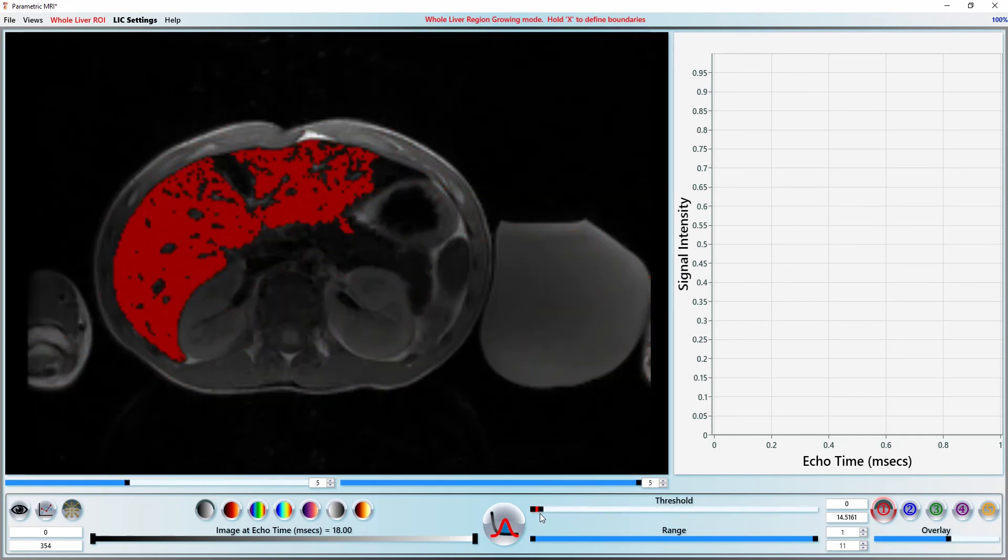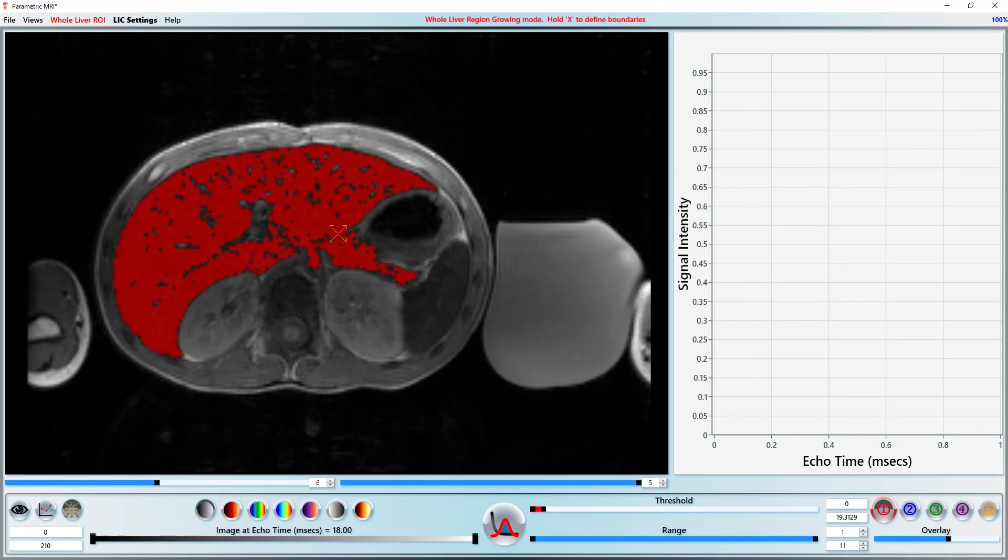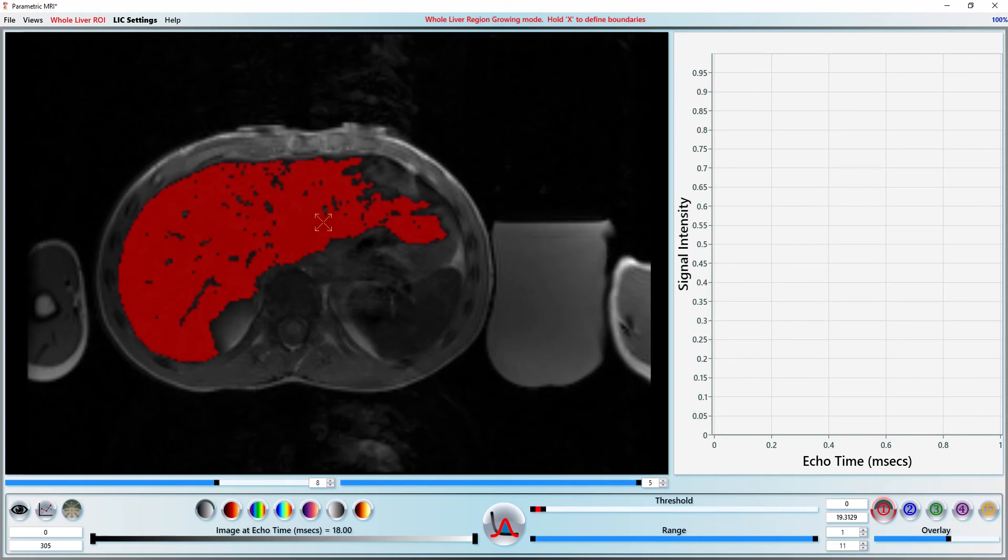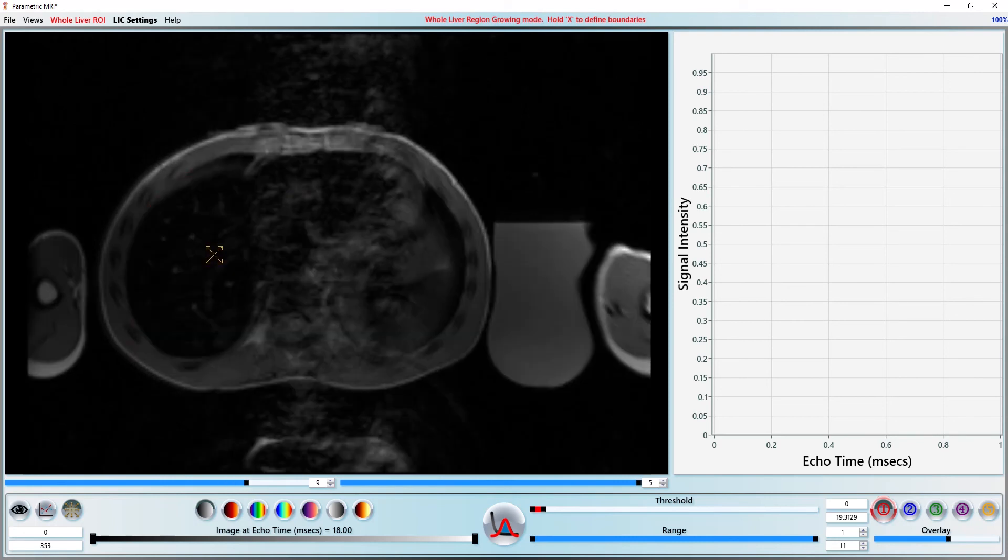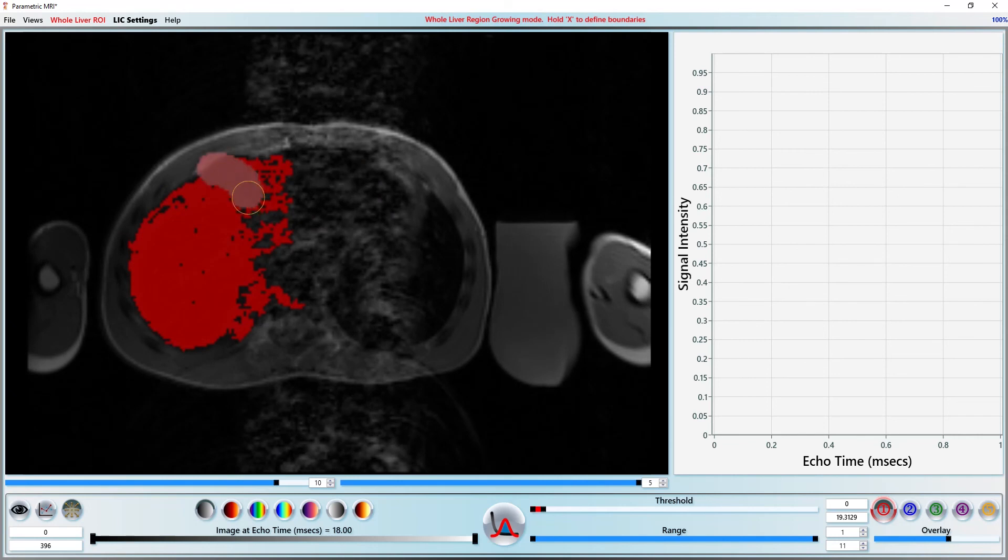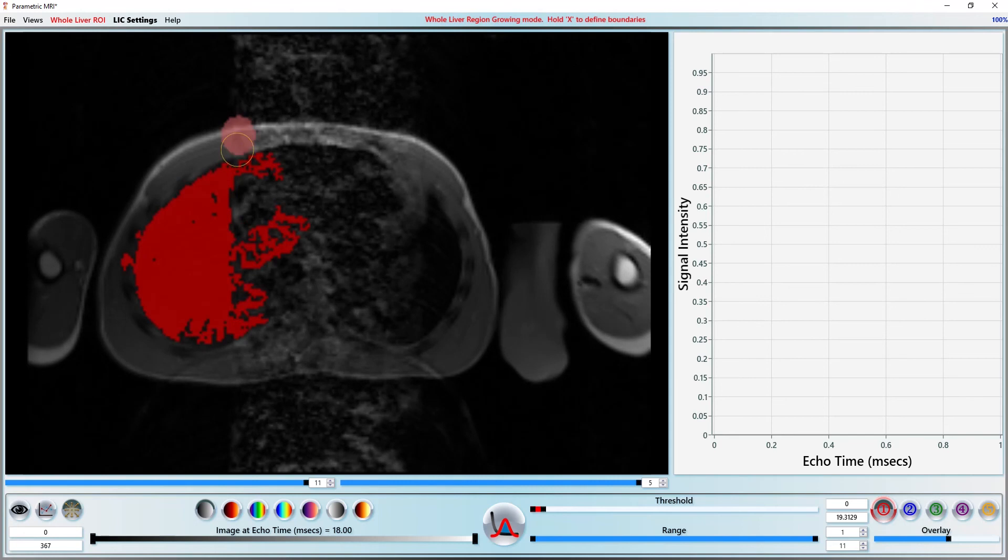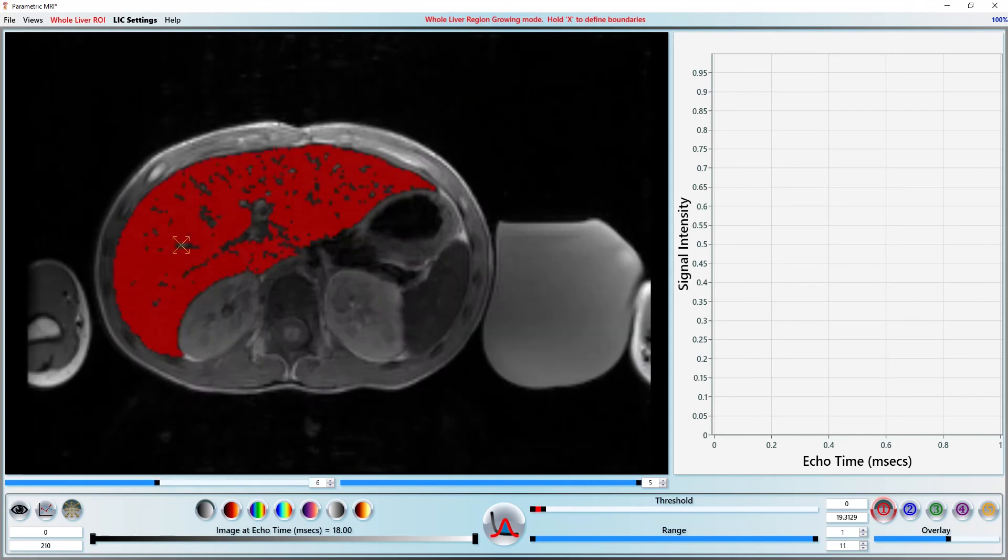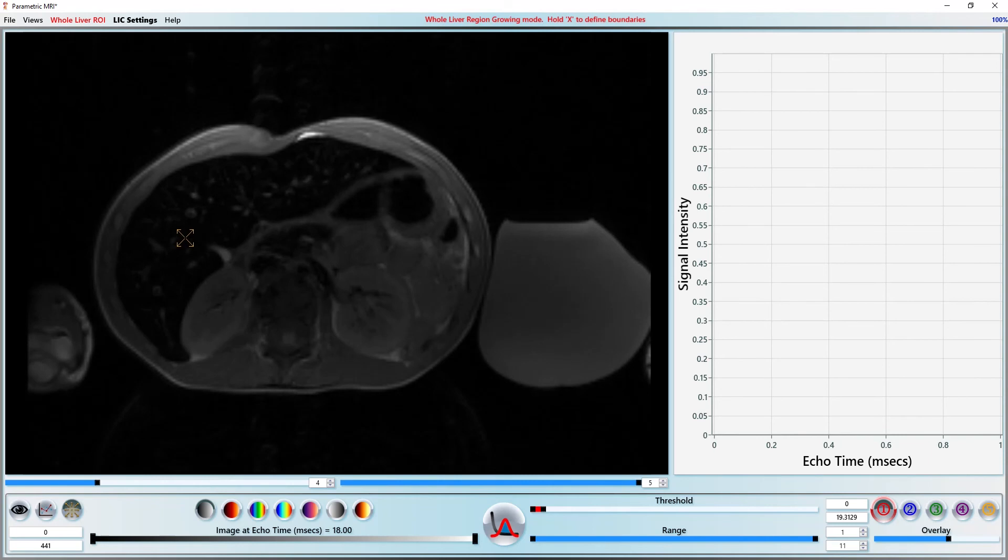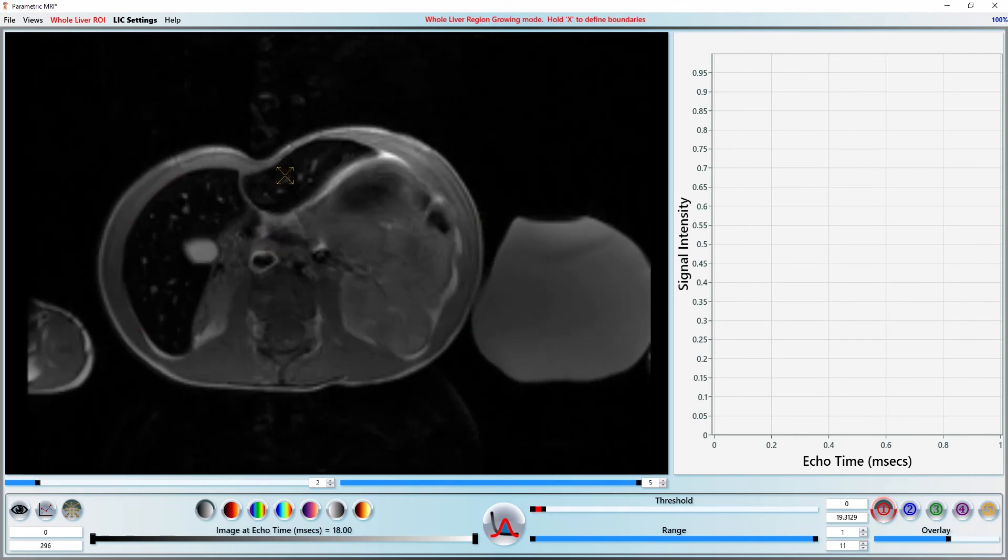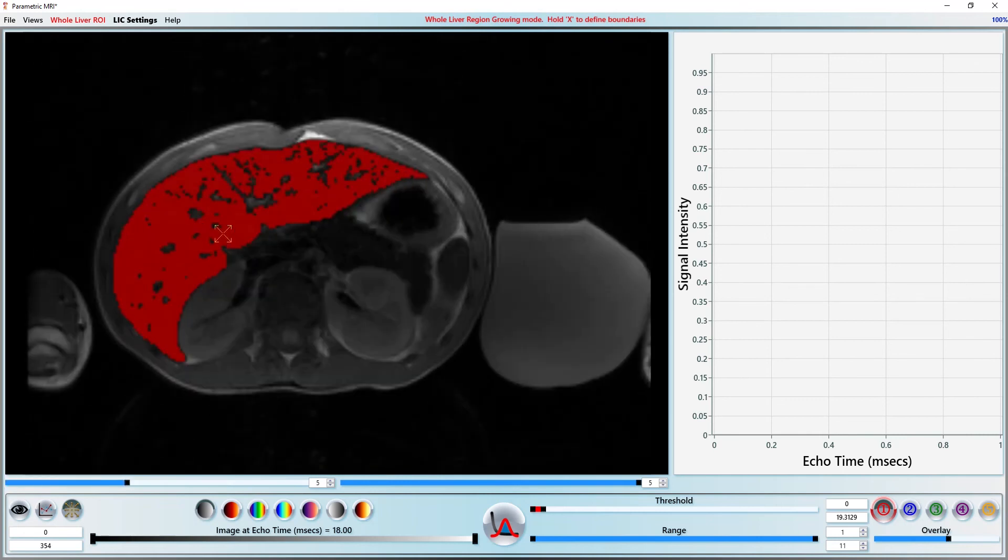Let's go slice by slice and region grow. Hold X on the keyboard and use the left mouse button to cut away any extraneous regions. We could do this all at once in 3D, but with this few slices, working on one slice at a time is faster.